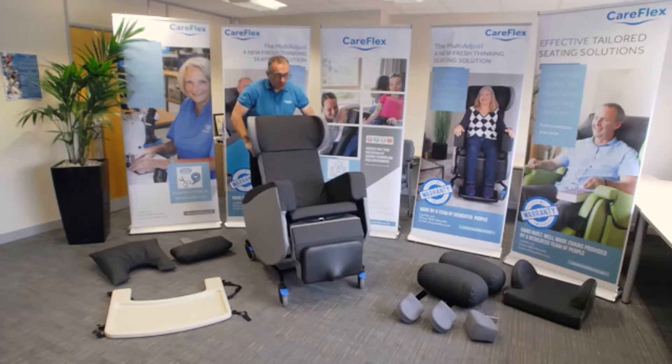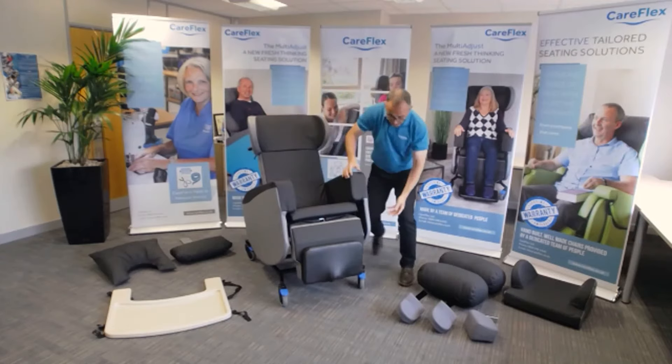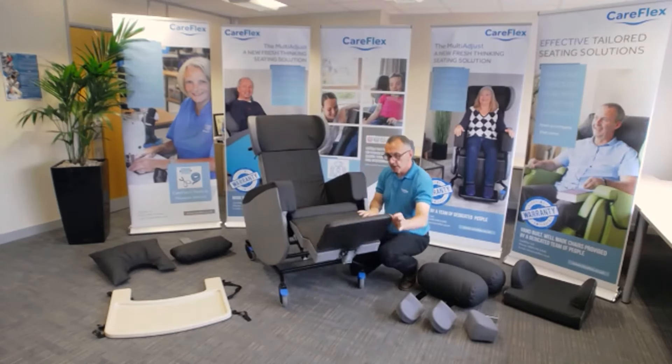As standard, the chair comes with seat width, seat depth, and arm height adjustment. It also has a built-in elevating leg rest with an angle-adjustable foot plate.